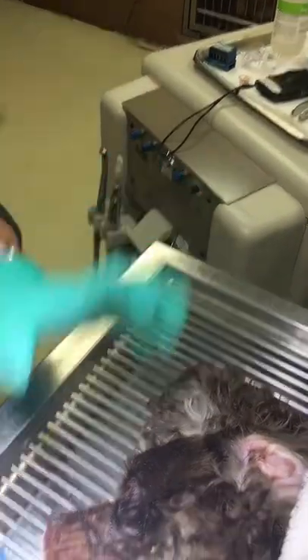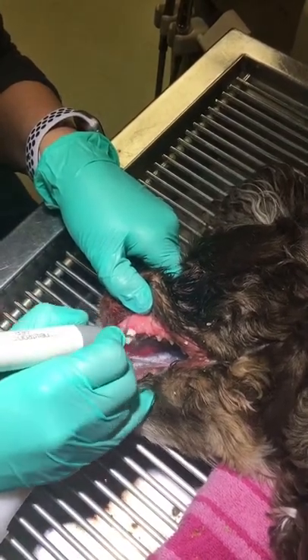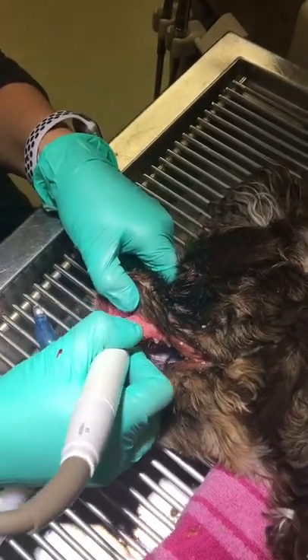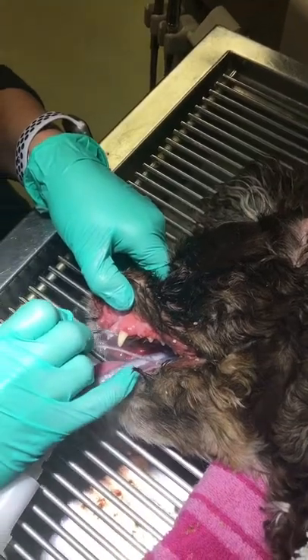Depending on your equipment, make sure to change your settings for speed and water level. Always make sure water is coming from the handpiece before beginning to scale. This will cool down the handpiece and the tooth to decrease the chance of damaging the enamel.